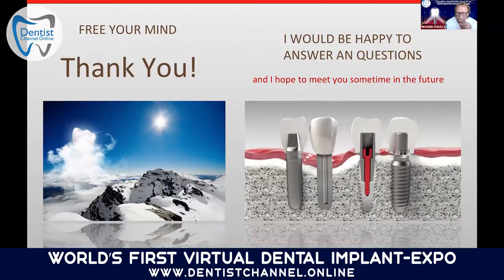20 years ago, I was going to people and they would say, no one is doing conical connections, so why are you doing it? Today, everyone is saying that they have a conical connection. It might not be a good conical connection, and they might have put just a small phase in there. But I think today it's very understandable that a worldwide implant company cannot just say, okay, what we did 20, 30 years ago is not the standard today, and we're going to change the implant system in total. So this is why they take other avenues and do different surface treatments. They try to change the outside of the implant, but it's very, very hard to change the internal connection of the implant and abutment once you have started back 20 or 30 years ago.